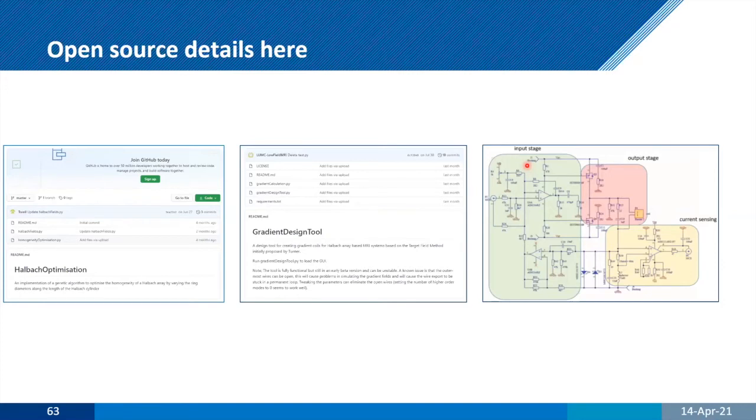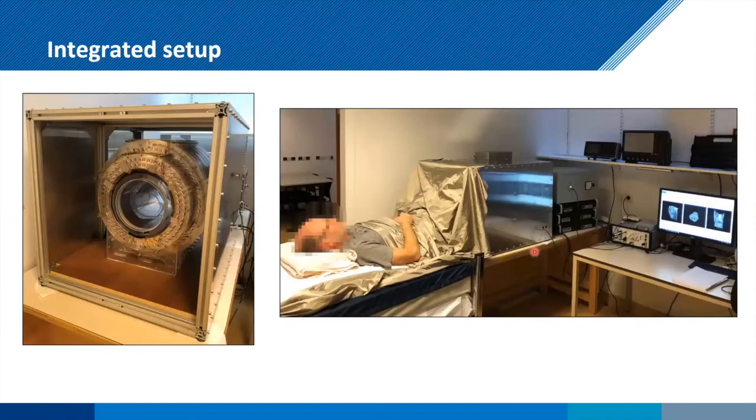So this is the other thing that we wanted to try and do. If other people want to build Halbachs using this optimization, they can go to GitHub and Tom's code is there. If you want to design your gradients based on the target field, Bart's code is there. If you want to look at the RF amplifier or the gradient amplifier, the schematics are there. And we've had a number of sites around the world who have looked at these and downloaded various of these. So again, the idea is let's try and make things sustainable. And also if improvements come in from different places, that's great. So here's our integrated setup. You probably have something very similar to your own.